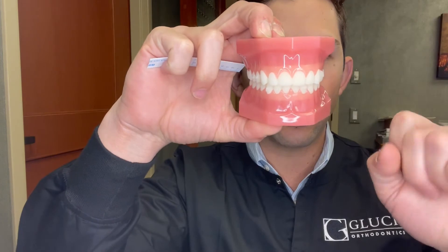Overbite is a measure of the up-and-down vertical overlap of those teeth. Overjet is a measure of the forward-backward overlap of the teeth. We'll start with overbite — there are a couple of different ways to measure it.